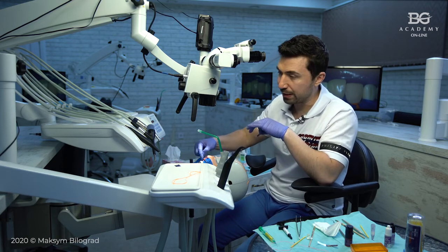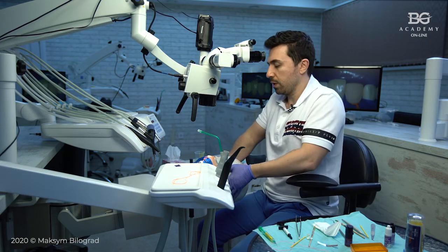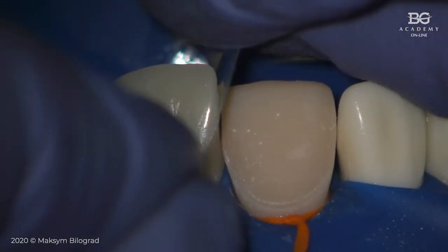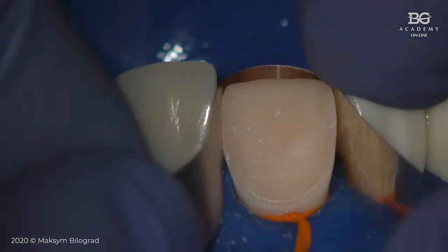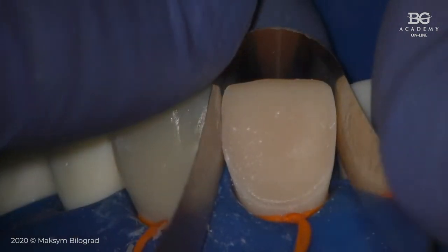So let's assume this central incisor, the adjacent central incisor, was not sandblasted. Now I will sandblast this central incisor, and I will take, see, there is another piece of cement here, so I clean it. I will put my metal band. It's really important to use this metal band to protect the adjacent tooth.